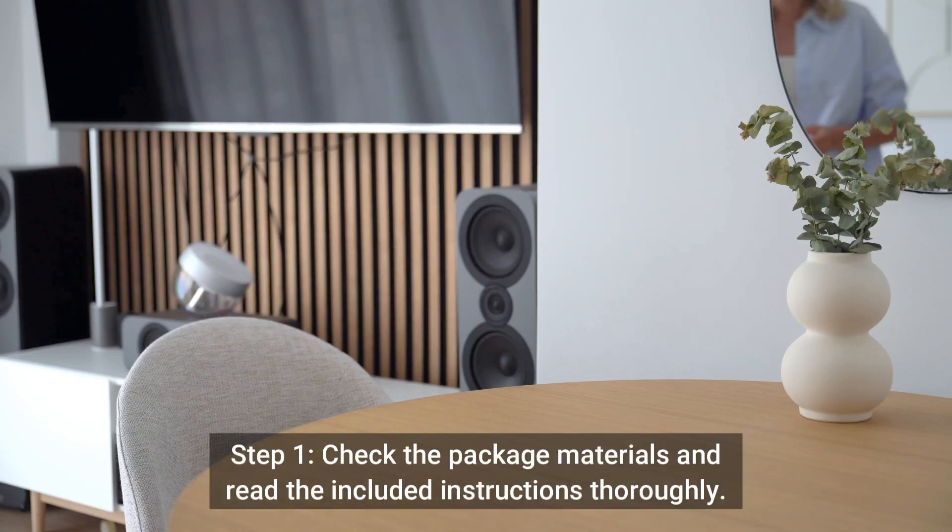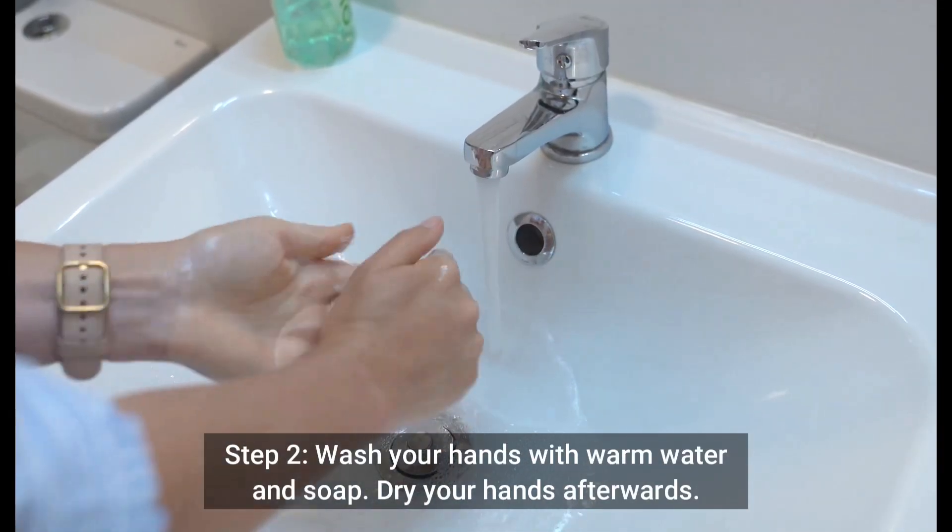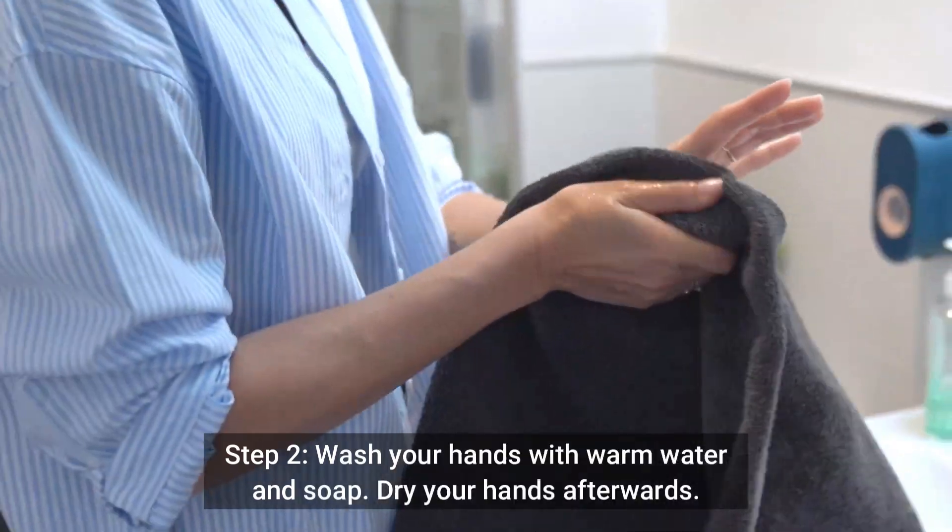Test procedure. Step 1: Check the package materials and read the included instructions thoroughly. Step 2: Wash your hands with warm water and soap, then dry your hands afterwards.